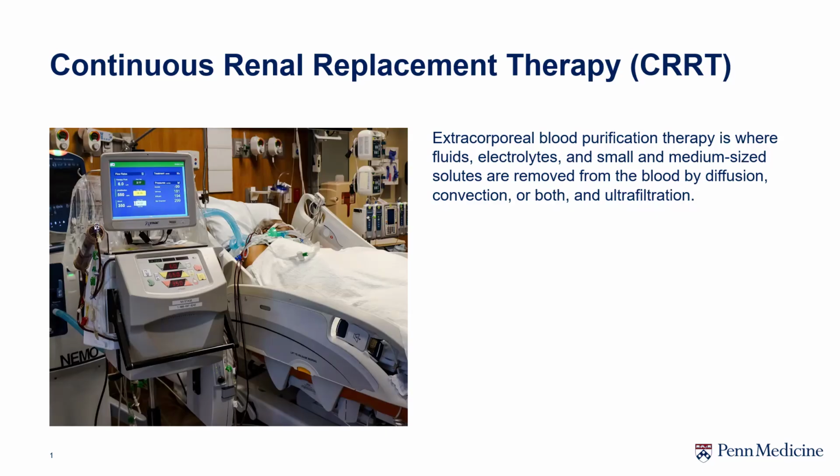So the first thing is, what is CRRT? CRRT is basic dialysis designed to work as a substitute for the kidney in patients with impaired renal function. And the difference between IHD and CRRT, which we'll talk about a little more in later slides, is that it's 24/7. It is, as the word says, continuous.